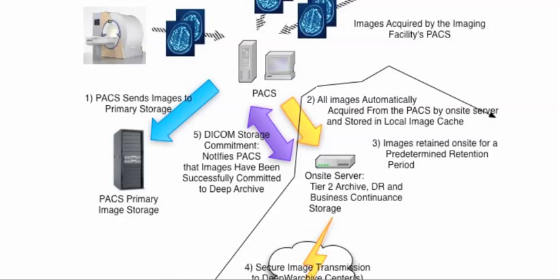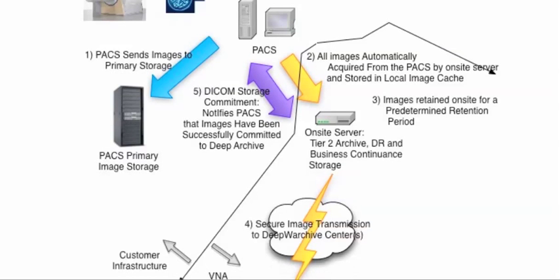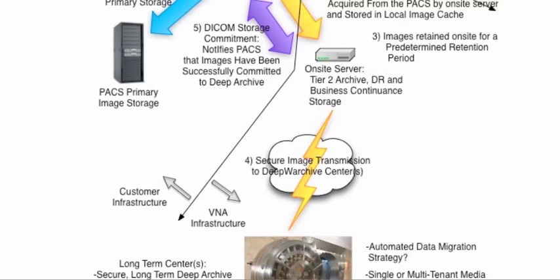So adhere explicitly to the standard so that you can guarantee long-term retrieval of the diagnostic study information, and provide some sort of documented data migration strategy. Other than that, it's typically just different vendor positioning capabilities within their technology solutions.